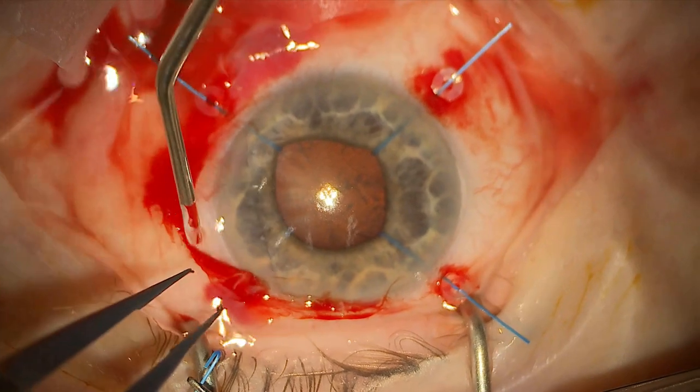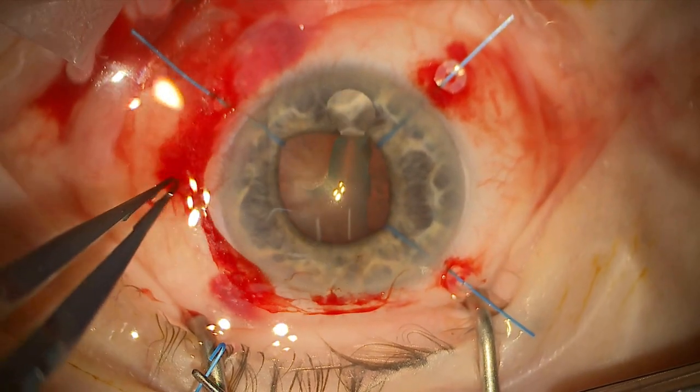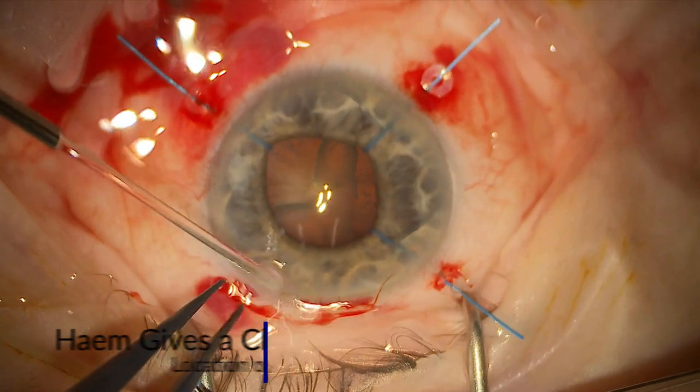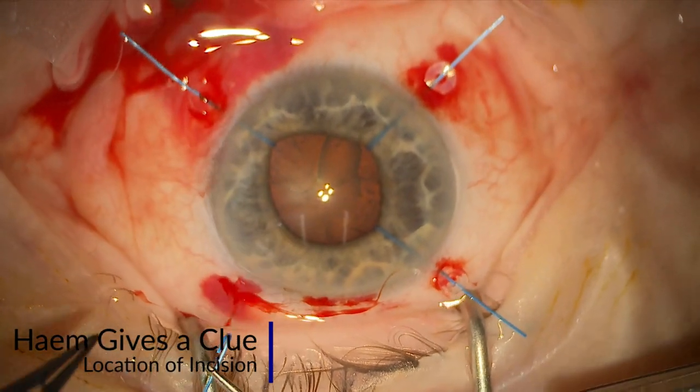After you've made your incisions, it can sometimes be quite tricky to remember where they are, so use the hemorrhage as a guide. You can see it gives a bit of a clue — after I clear things up here — where the incision is.